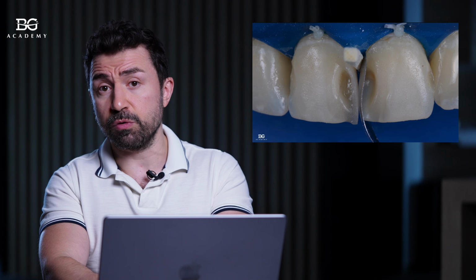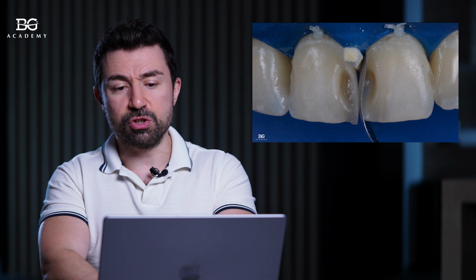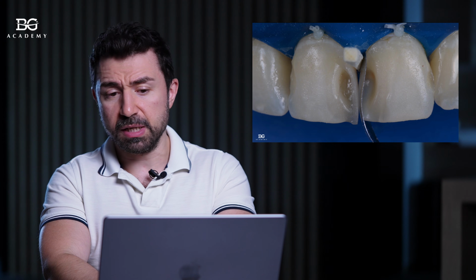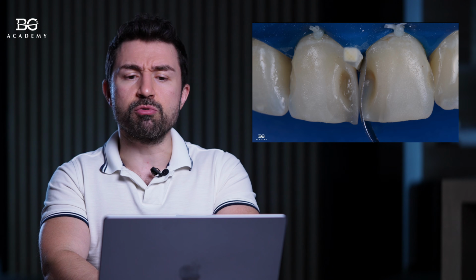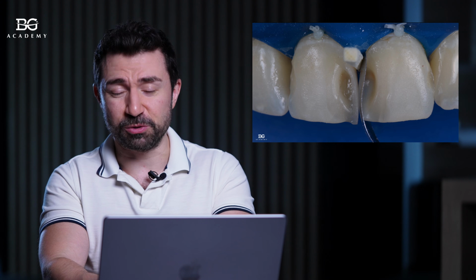So now we have the matrix for the adjacent tooth. By the way, I would like to point your attention to the mesial profile of the tooth 1.1 that was already restored. You can see it's more straight because of the matrix manipulation. So now I'm going to restore the adjacent tooth, which is 2.1, sorry.